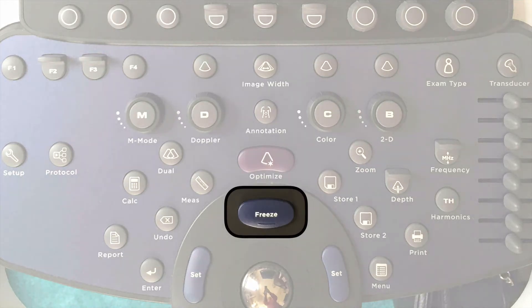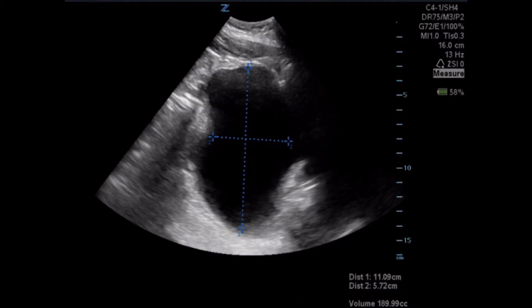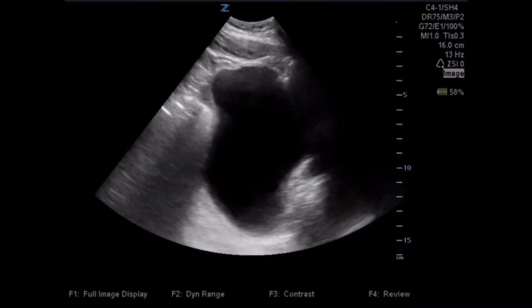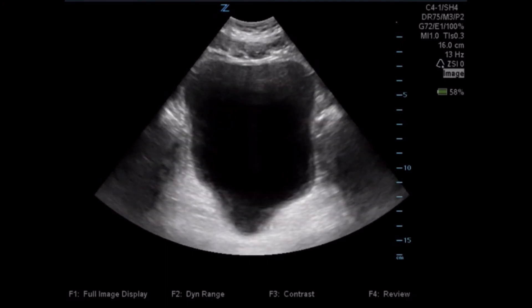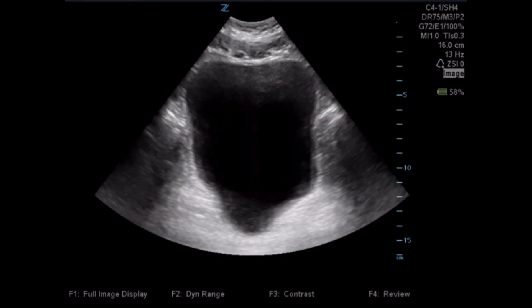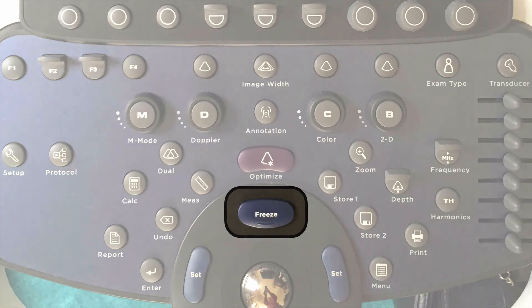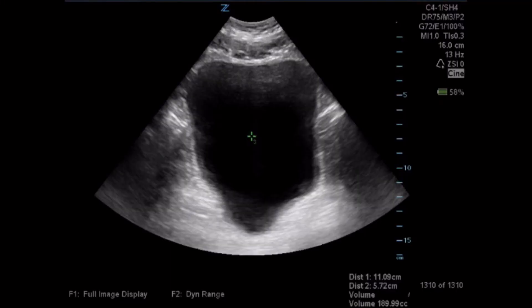Now we're going to unfreeze our image, and once we unfreeze it, you can see that we can rotate to a transverse plane. Once we have a nice transverse plane of the bladder, we're going to press freeze again. Once we've frozen the image, caliper set number three automatically pops up because we've saved calipers one and two by using the enter key.